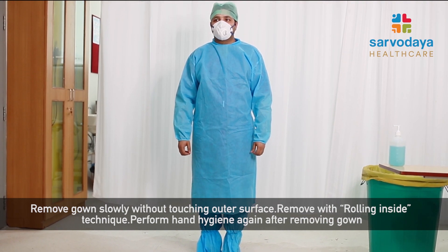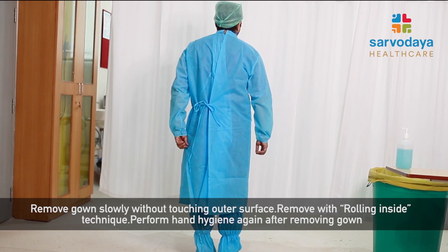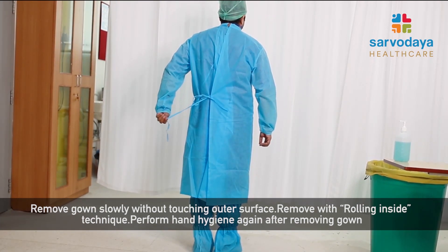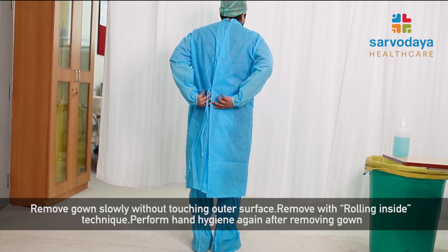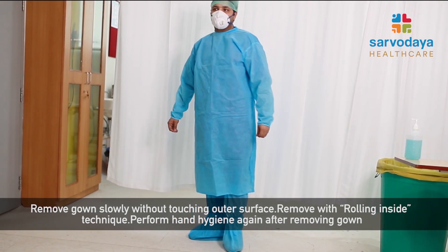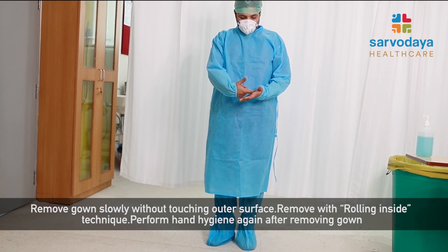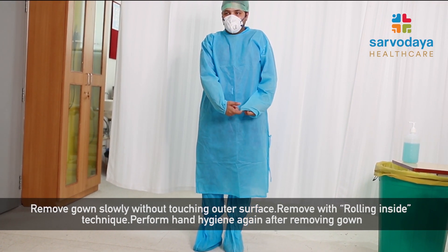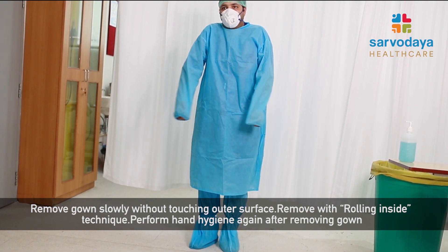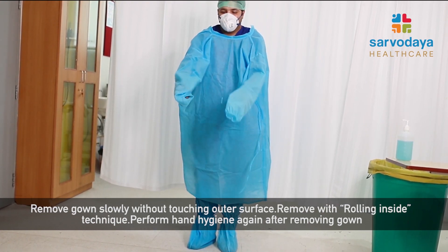Now we will be showing how to remove the gown. We need to touch the most uncontaminated part of the gown, which is the back side — the straps or ties whichever is available. We untie the gown without touching any other surface. Since our gown has an elastic cuff, put a finger inside the under surface of the gown without touching the contaminated areas and try to pull on the sleeves. Then with a gentle motion of the shoulders, try to wriggle yourself out of the gown.